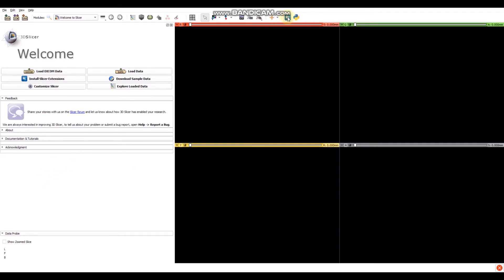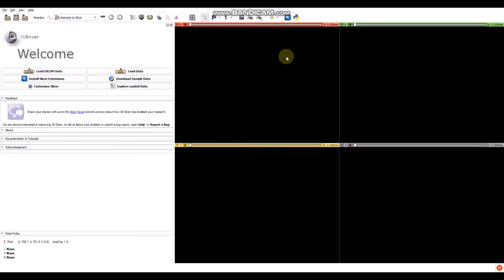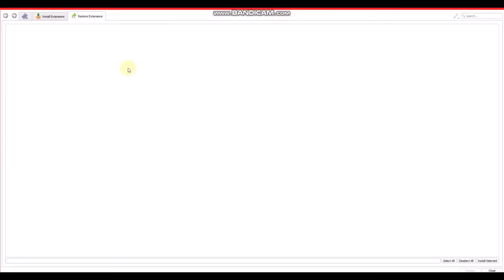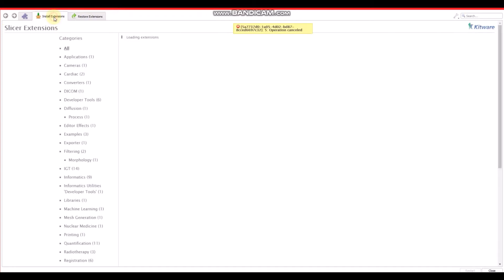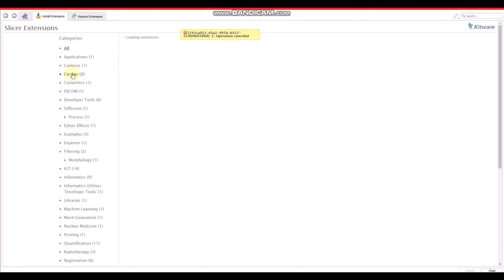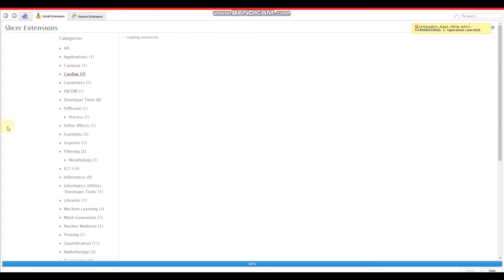It is at the top of the slicer — it is the blue icon here, so click on it. We have to wait for it to open. We will see this window. We have to look for the cardiac section.